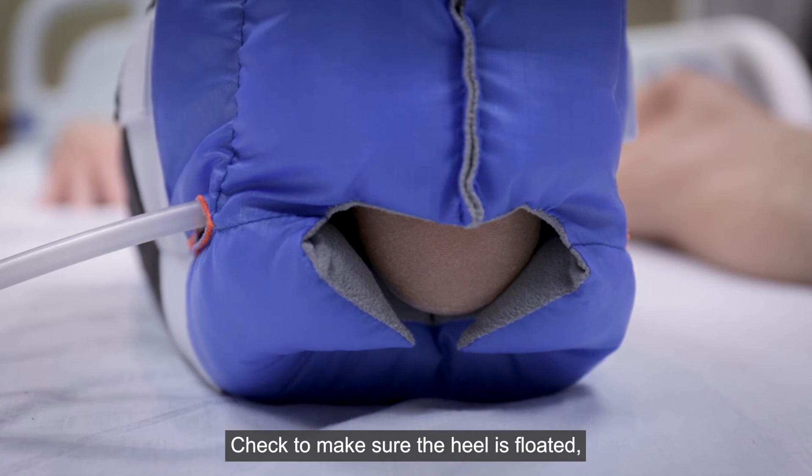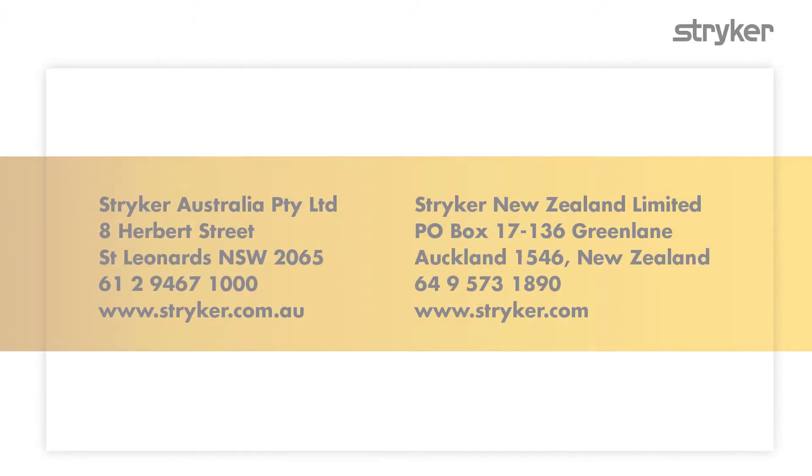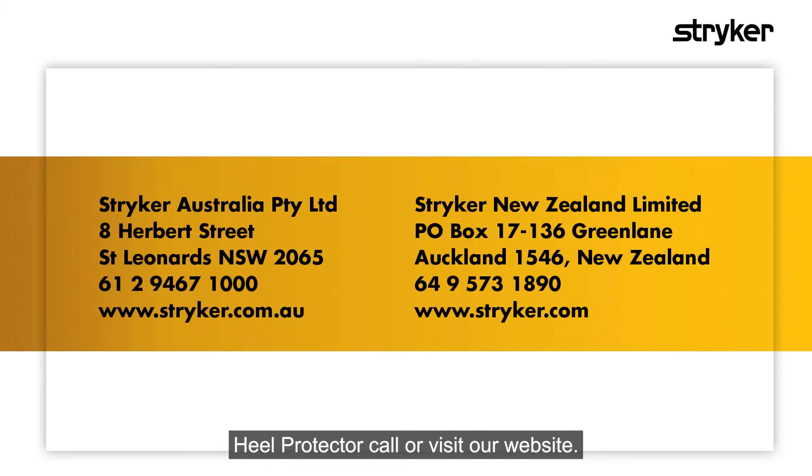Check to make sure the heel is floated. Readjust if necessary. To learn more about the Prevalon Heel Protector, call or visit our website.